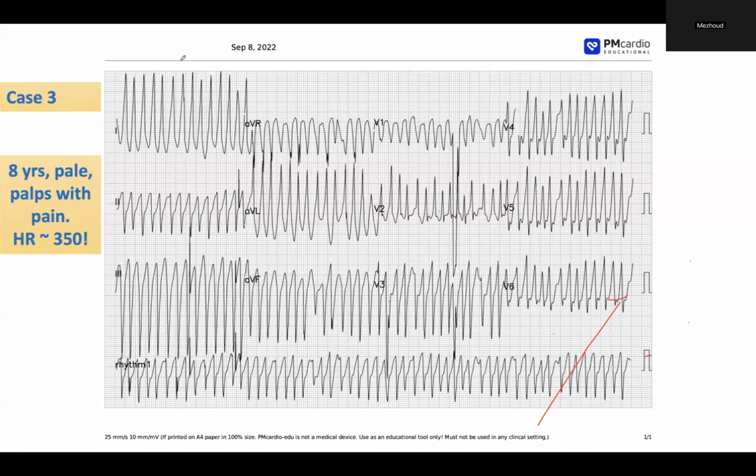So I heard probably wide complex tachycardia, right? Large meaning wide complex, right? Quite very quick, yes, and irregular. Yeah, excellent. I mean, people here are very smart. So irregular, wide complex, polymorphic looking, and very rapid. He's only 8 years old. This is a patient of mine, only 8 years old. Obviously, still not fainting, but sick looking.